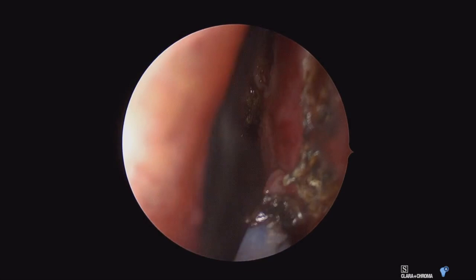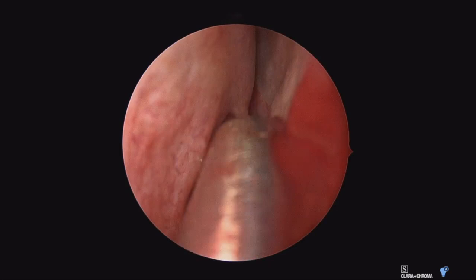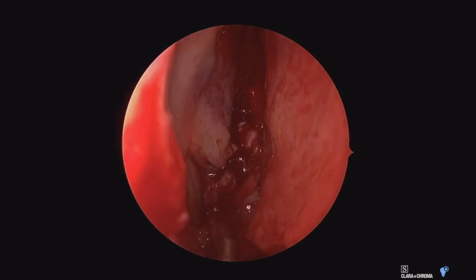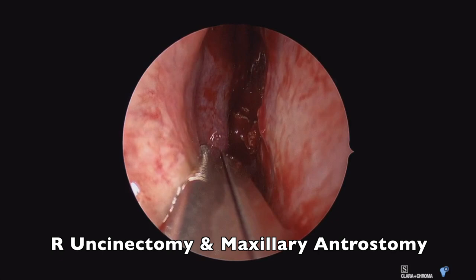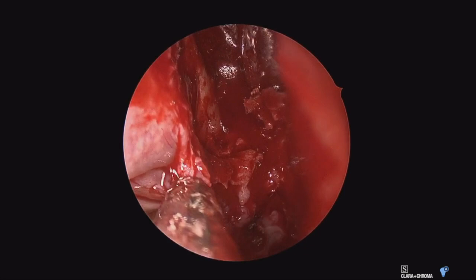Here we are outlining the mucosal incisions for our right-sided nasal septum, then going ahead and taking out all that bone and cartilage to complete our septectomy. The most important thing in these cases is to completely remove the tumor and obtain negative margins. There are different tools — purely endoscopic approaches, combined approaches, and purely open approaches — but the approach selected should be dictated by the tumor and what you're most comfortable with to obtain complete tumor resection.